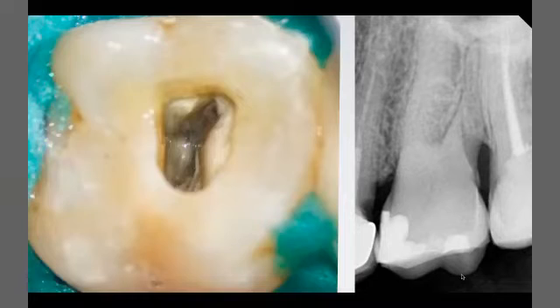You can see now I am reaching the dark dentine. I am reaching my floor map, and I have already removed the calcification over the mesiobuccal canal. But I still have some white spots on the distobuccal orifice and also on the palatal side.